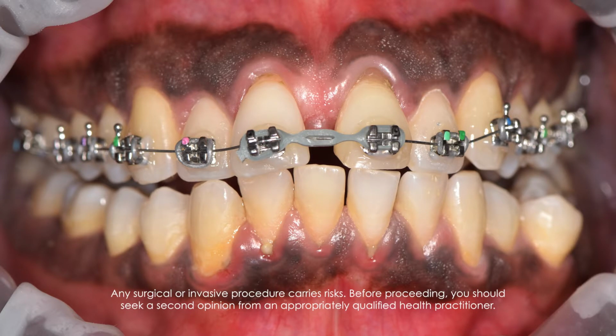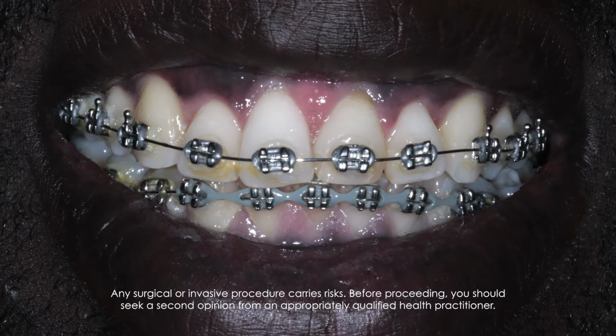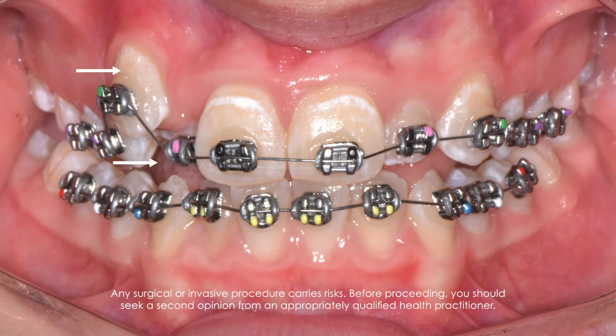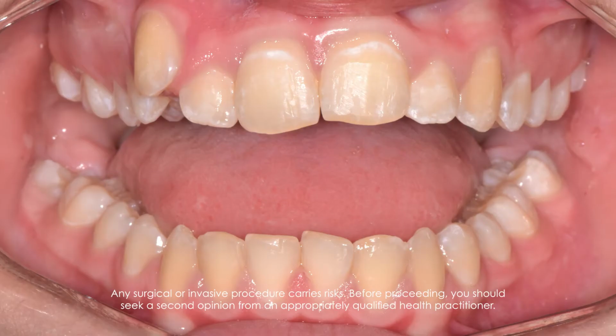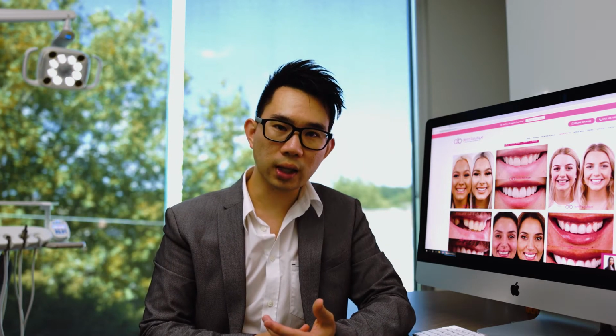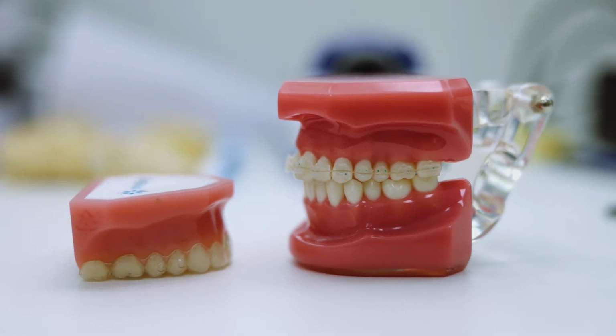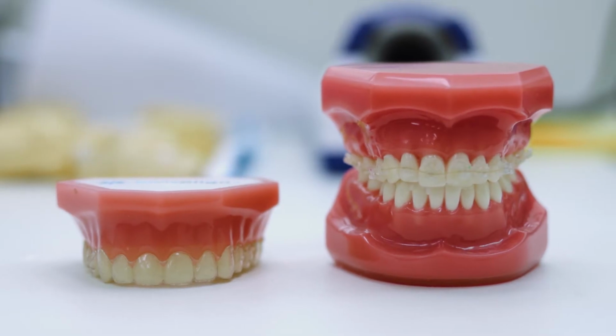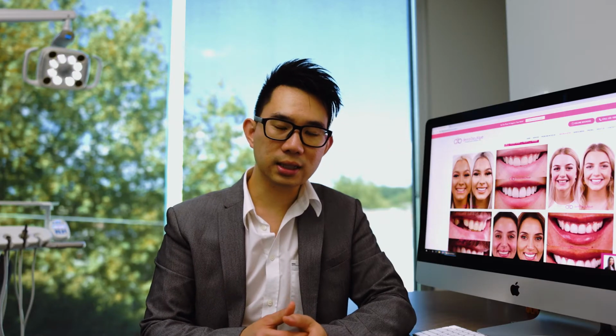Number two, it helps to move certain teeth more effectively. One of the key factors with braces is that it's very helpful in moving impacted teeth, most often canines, where if the teeth are stuck up in the palate or right up to the back, we can pull them down a lot more effectively compared to any clear aligners or Invisalign. It's just the mechanics of it. So if you've got any impacted teeth and you want to bring them down, that will be a really good method to do it. The third one would be in terms of uprighting teeth. Braces sometimes would be a more efficient way to upright some teeth as well, but again, it's a case by case basis.